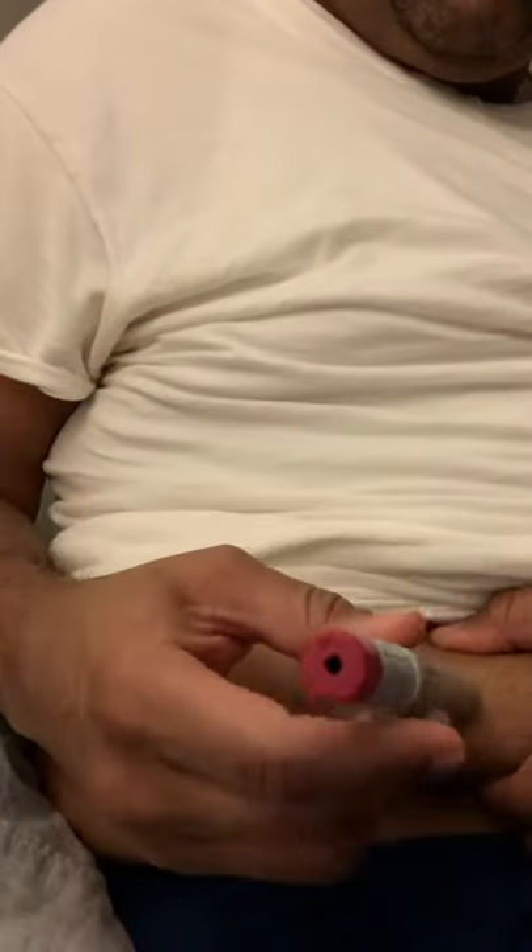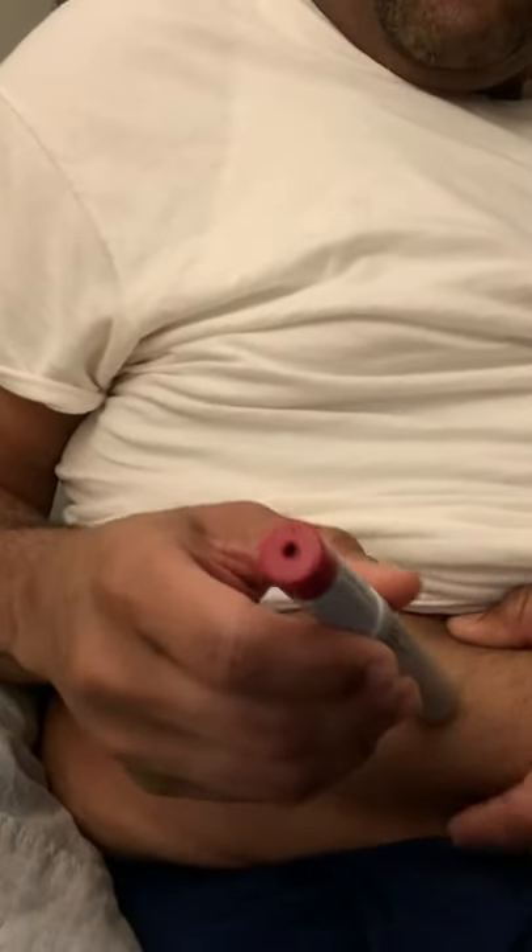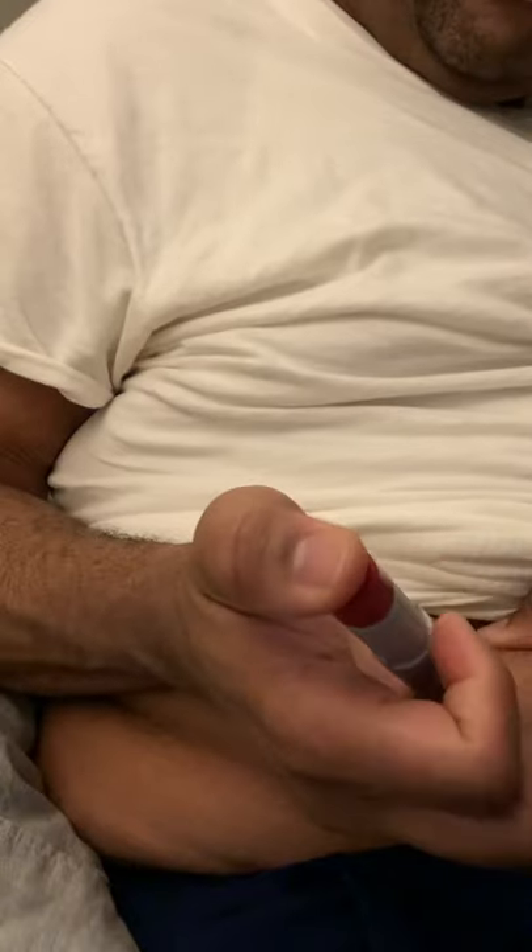What you do is hold this against your skin, press number two down — which is the red side — and hold it there for up to 10 seconds after you hear the noise. And let's go.